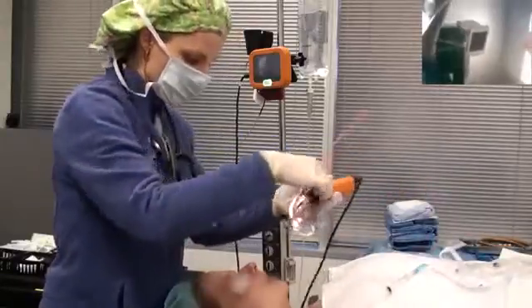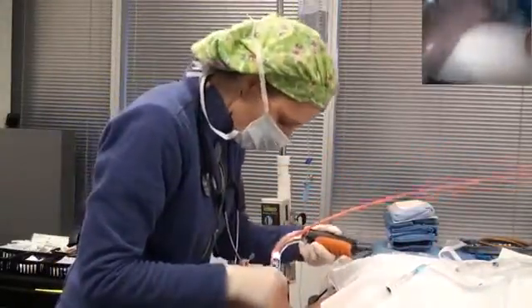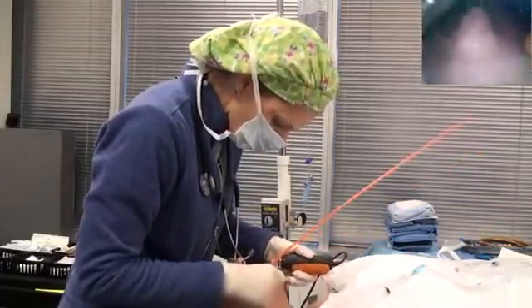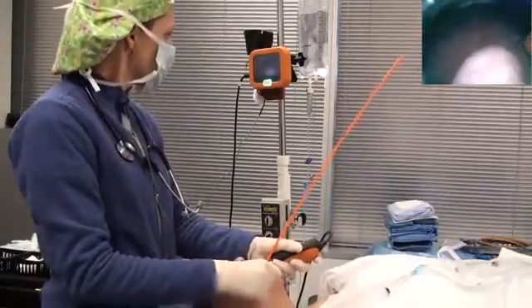What you want to do is open your patient's mouth and be sure to watch as the disposable sheath goes behind the patient's tongue. Once you see it disappear behind the tongue, then take a look at your monitor.